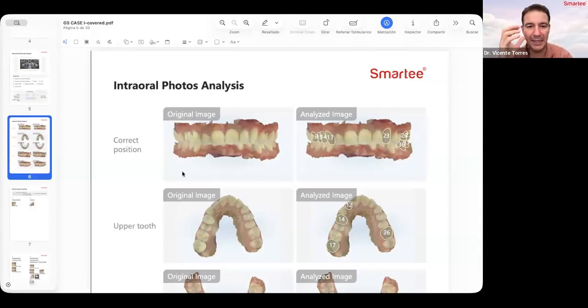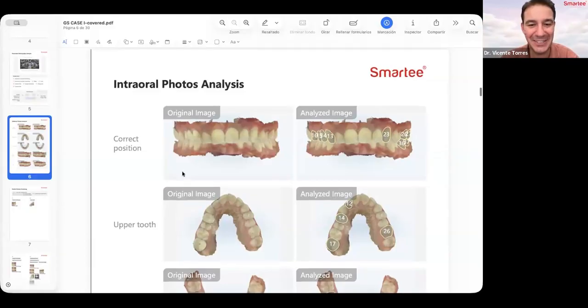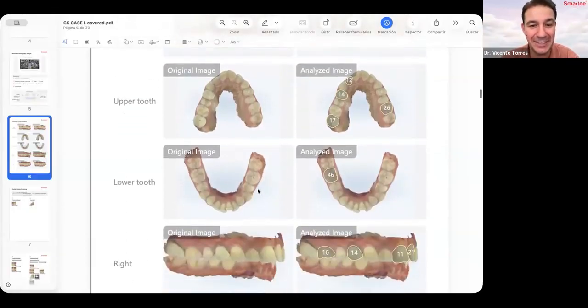I hope I explained it well, because it's sometimes complicated to understand distalizing the lower arch in a class two. But in that case, it's mandatory, because the other option, if the patient rejects the mini screws, is maybe doing a lot of IPR from mesial to mesial of molars, in order to align the teeth, retro-incline a little, and make this mandibular advancement.